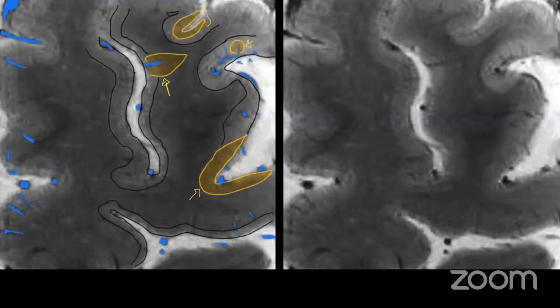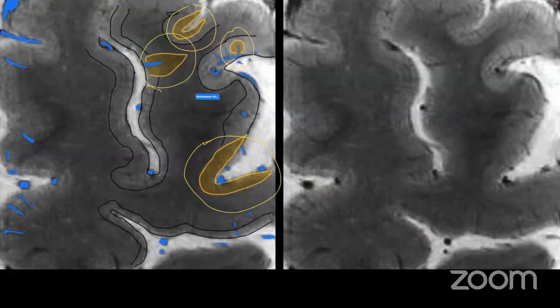It is the most diagnostic, but the least likely to be picked up, which is quite unfortunate for us. The most specific to confirm a diagnosis would be the subpial ones, but these are practically for the pathologist. They are able to see them under the microscope, but they are very difficult to see on the scan. Sometimes we are able to see that one, which tends to be specific to MS, and most commonly we see that one, which is not specific by any means, or the least specific of the four types.